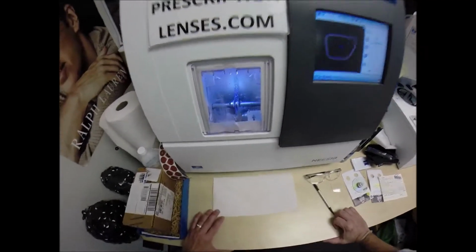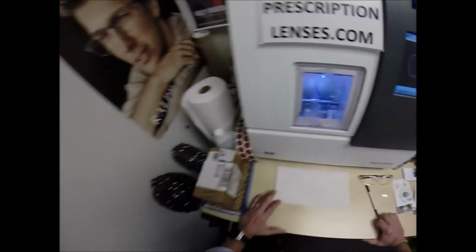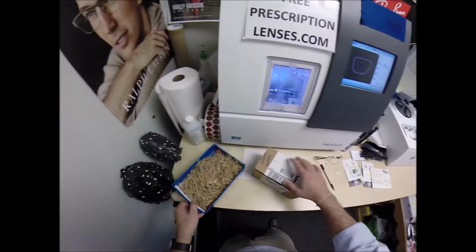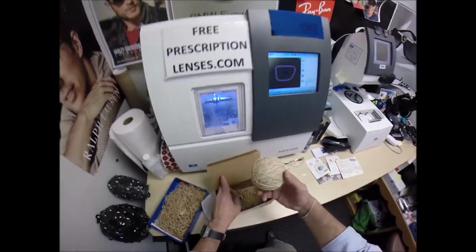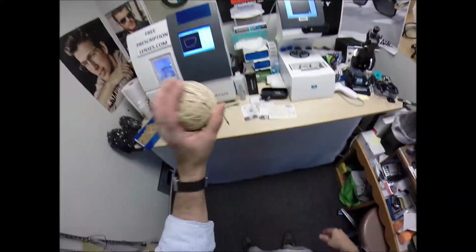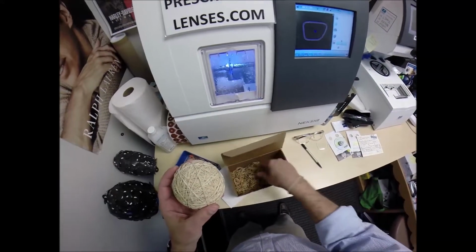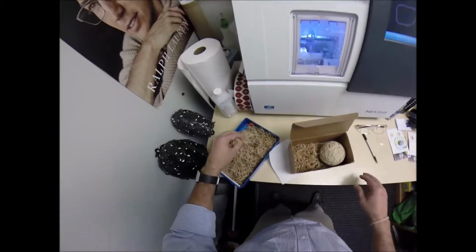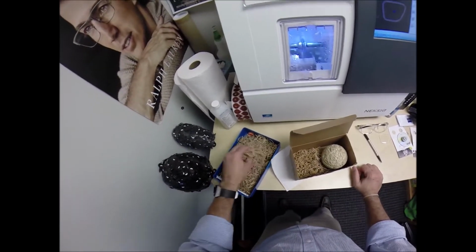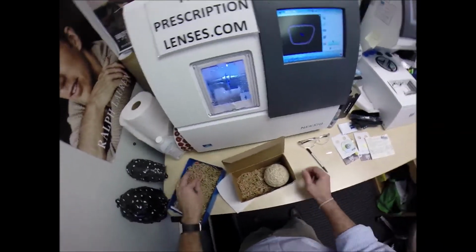What do y'all think? So water has begun spraying onto the lens, so it tells me it's in the last 20 seconds. Speaking of which, as things get slower during this coronavirus, now would be a good time to do it. I've been making a rubber band ball with all the lenses that come wrapped in rubber bands, and I just throw them into this box, and then into this box when this got full. Should I ever really need to shelter in place, or since it's slow during the days, I'm going to catch up on this, and wait till you see.